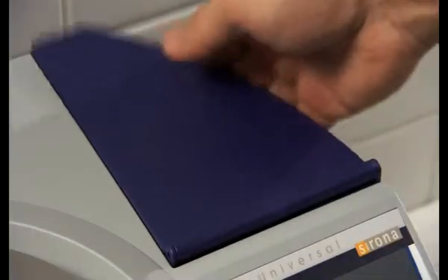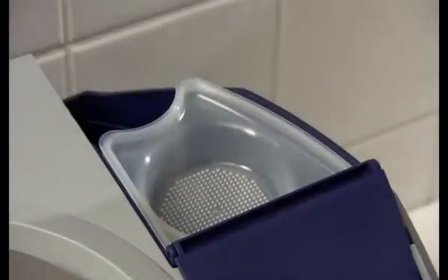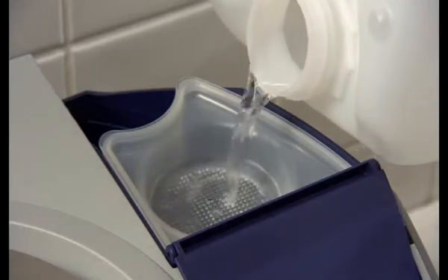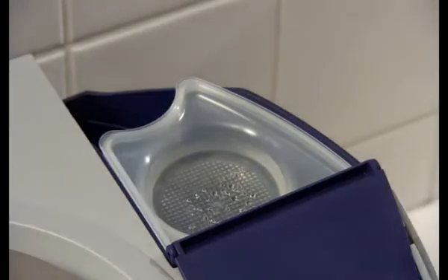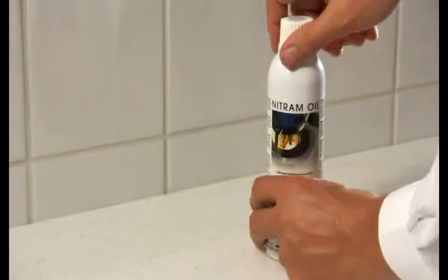If no water treatment system is mounted, please fill demineralized water directly into the water tank. The water quality limit is a maximum 3 µS. Place the nitram oil bottle upside down beside the water tank and fasten gently clockwise.